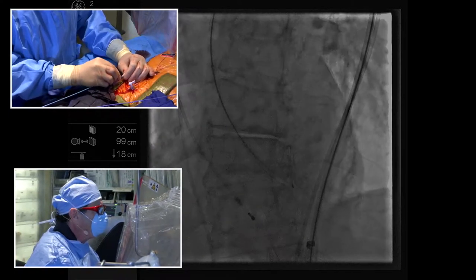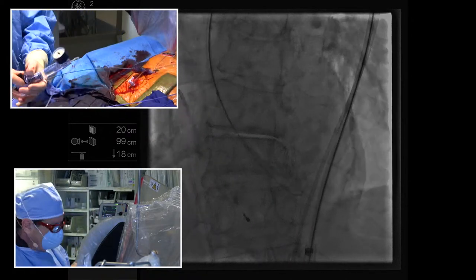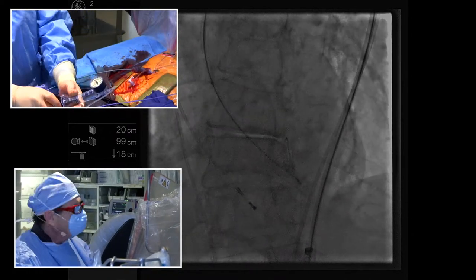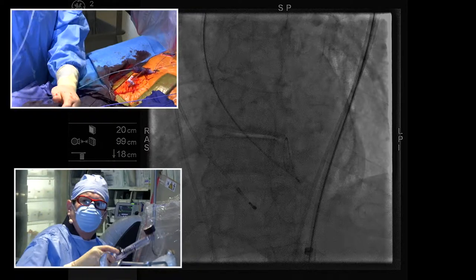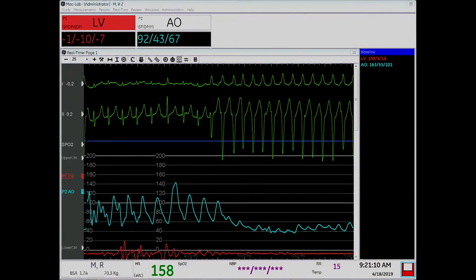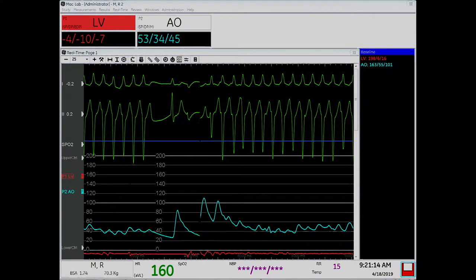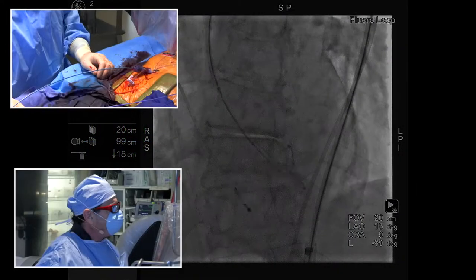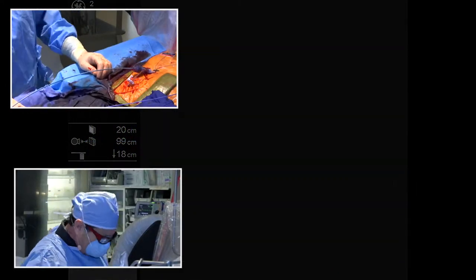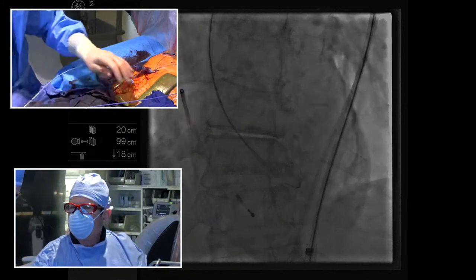That's the markers that went through very nicely. All right, so we're gonna pace. You ready? All right, so I'm gonna blow up the balloon with this little handle here. Pacing is on, balloon goes up, and then balloon down, stop pacing, and we can store that fluoro, so you can see that we'll play that back for you. Pretty easy job, right?